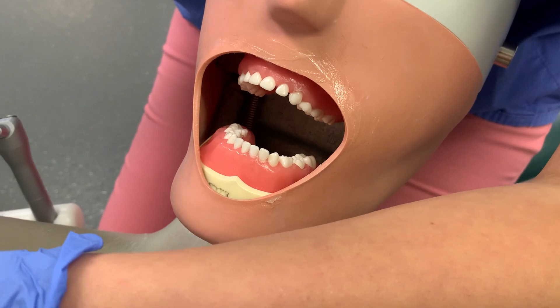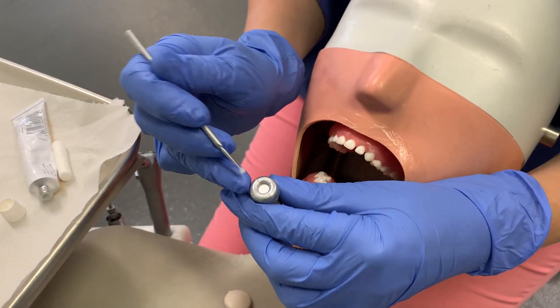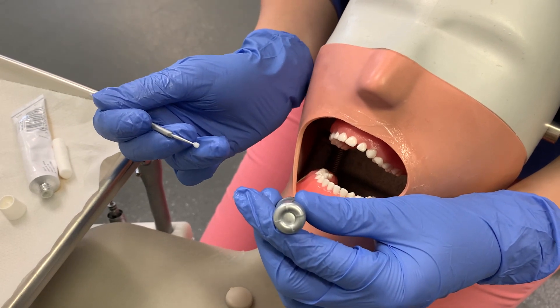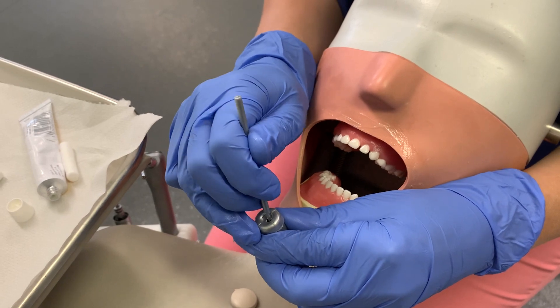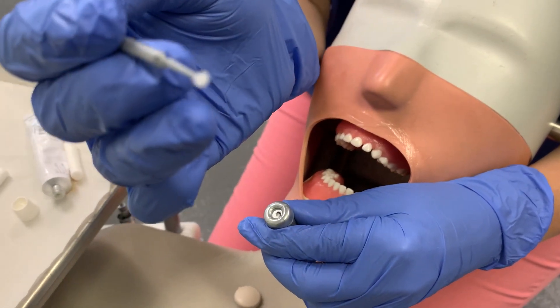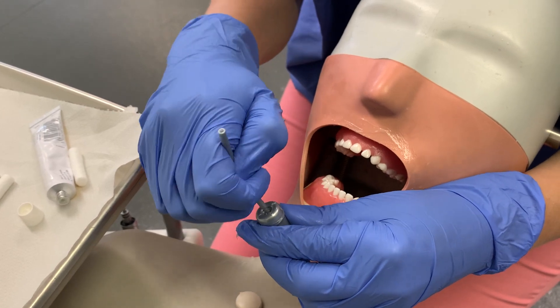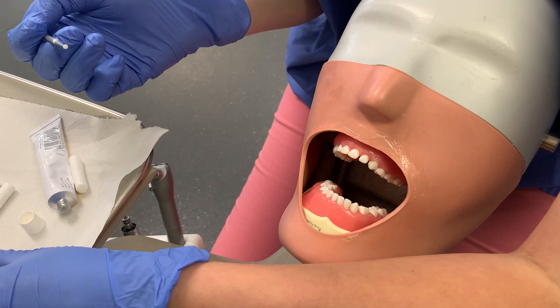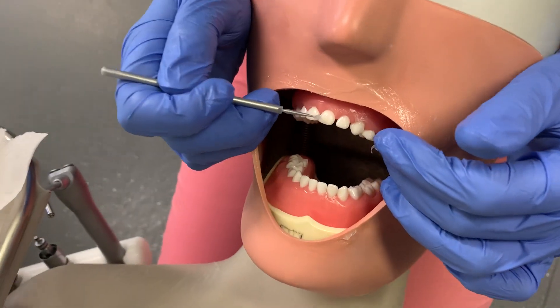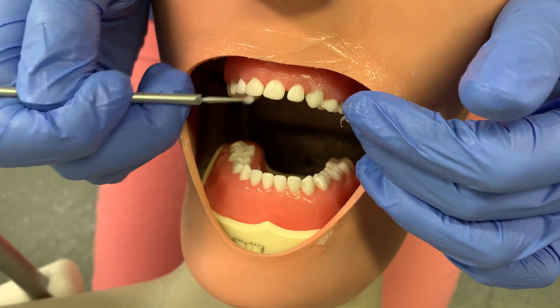The next step is to pierce the SDF liquid. It's stored in the fridge and it comes in this little single capsule — it's one capsule per patient. You just pierce that with a micro brush. You can see it's just a liquid, not a paste or a varnish — it has a viscosity a bit like bond but less sticky. Then just really carefully, because you don't want to get it onto the soft tissues, you're going to paint it onto those teeth.